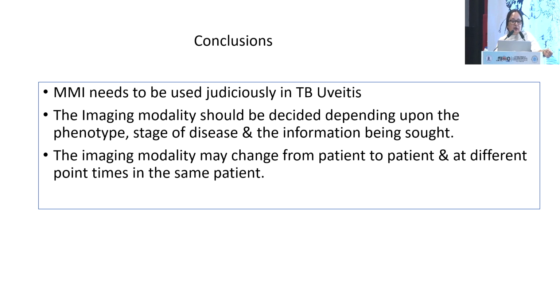So to conclude, you have to use these very judiciously. I think this applies to TB uveitis, and overall in uveitis. The imaging modality should be decided depending on what the phenotype is, what the stage of the disease is, and what information you are getting. Always ask yourself a question: this is the answer I want, decide the imaging modality, and when the result of that imaging comes, that answer has to come.